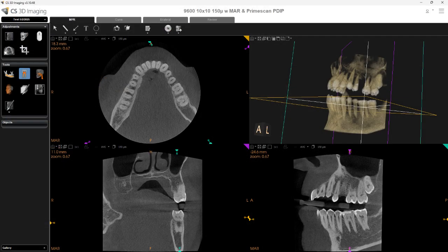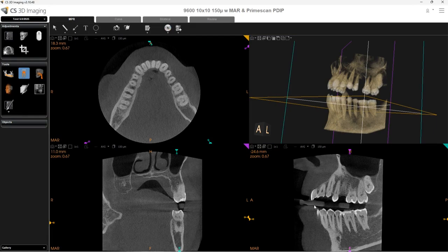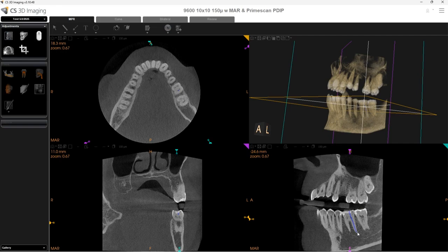When the Tracing tool is selected, the opacity of the 3D rendering is automatically reduced to enhance the visibility of the traced canals. Left-click on a canal to begin the tracing. Release and left-click again to continue tracing. Repeat these steps until you reach the end of the canal. When you are finished, double left-click to end the tracing.